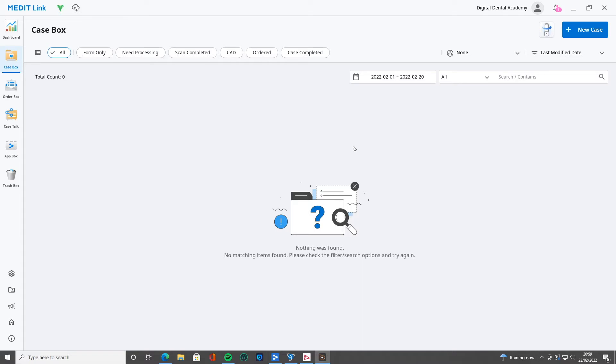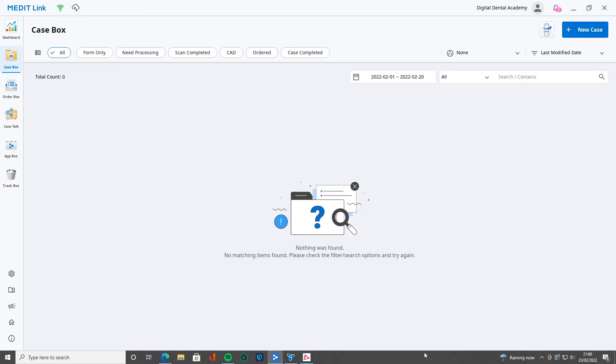And today's tutorial, I'm just going to show you something very simple. This is how to set up your partner links. If you're not creating things in house, if you're sending to a lab, then you need to know how to set it up.